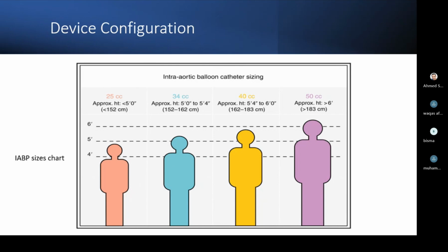But actually, when we're discussing the balloon, we are discussing blood displacement. So we must consider the blood displacement instead of the insertion approach. My suggestion was only on these two catheters. I mean, they offer the same kind of occlusivity and the length of the catheter. That's my information.